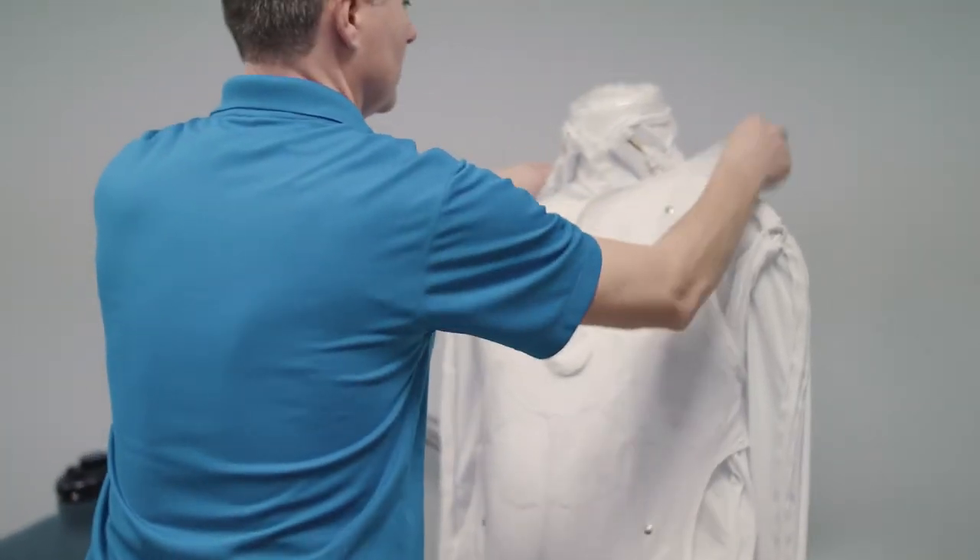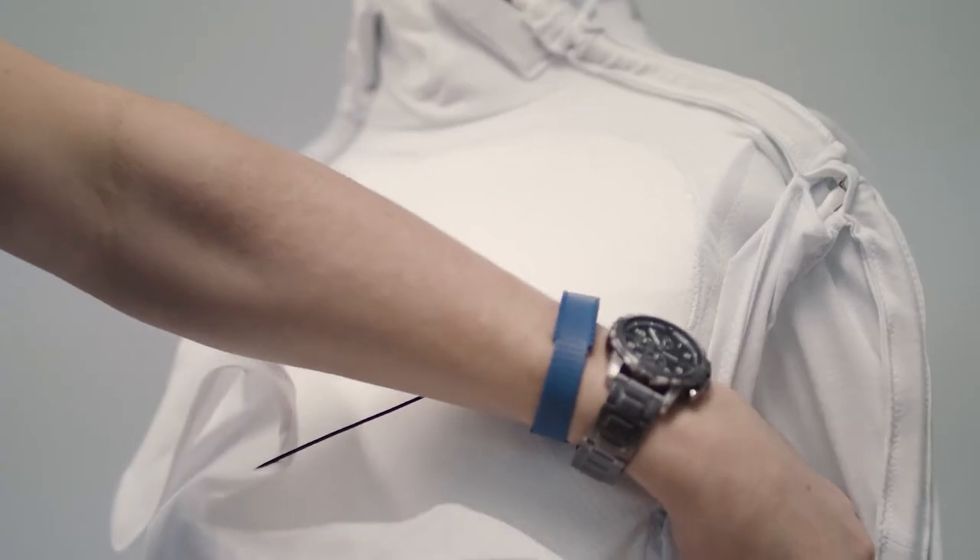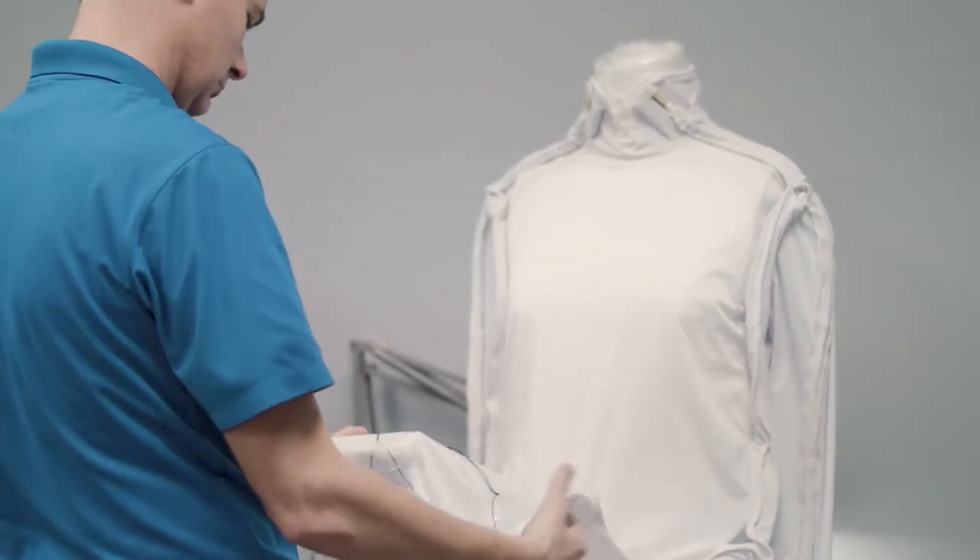The overarching concept for our product was to keep the technology a little bit separate from the garment, so that the technology could be almost like the hood of a car — you can open it up, see the technology, access it, replace it, and maintain it.